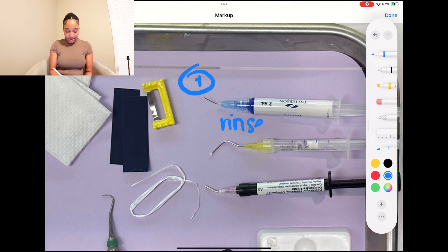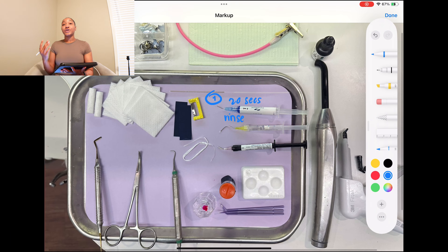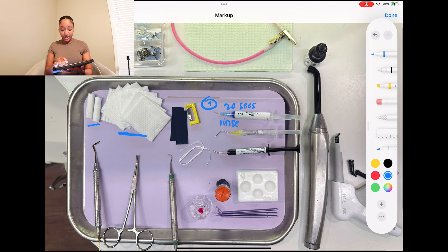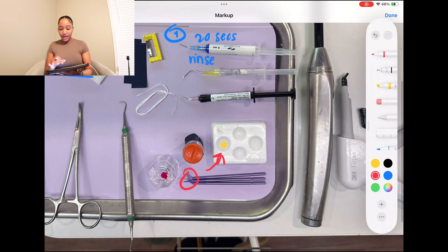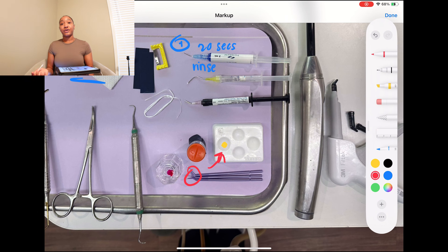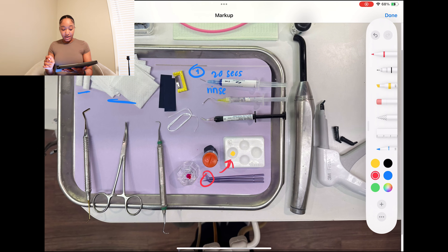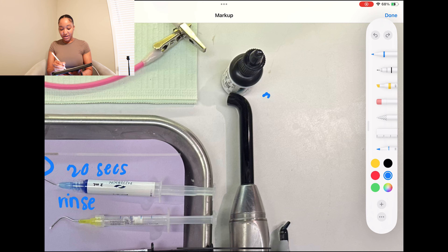So you'll place etch on for 20 seconds and then rinse that off and dry the tooth. Usually after this, my doctor will go in and actually isolate the tooth with a cotton roll and a little gauze. Now this is when you're going to get your bond — squirt your bond in, get a micro brush, dip it, and hand it over to your doctor so they can dip it, go back to the tube, and return the brush. After that, your dentist will air dry the bond using the air-water syringe, and the next step is to cure.